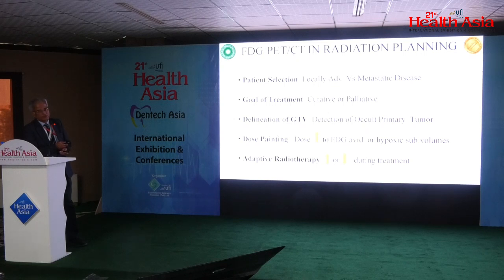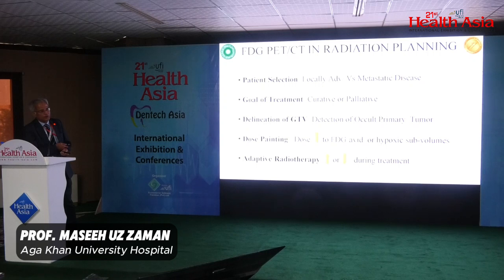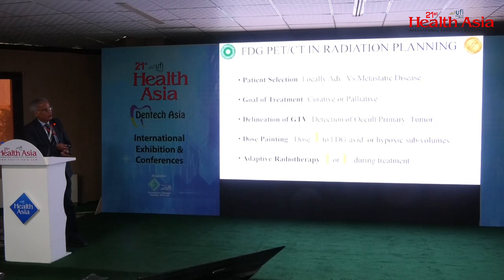And by using the FDG PET-CT, they can do a precise delineation of the gross tumor volume. And by using the dose painting technique, they can always escalate the dose to the hypermetabolic or hypoxic subvolumes of the tumor. Similarly, in the adaptive radiotherapy technique, the radiation oncologist can always decide to escalate or de-escalate the radiation dose during the phase of the therapy.